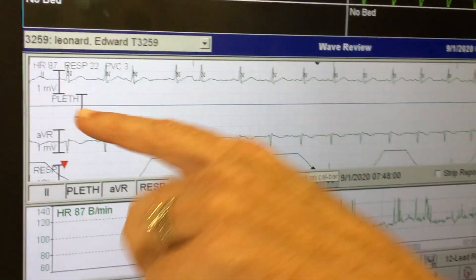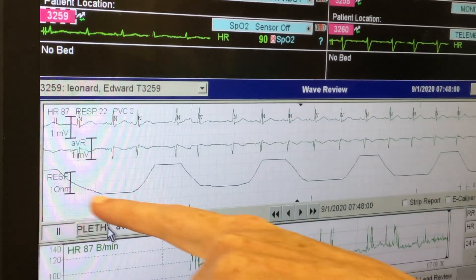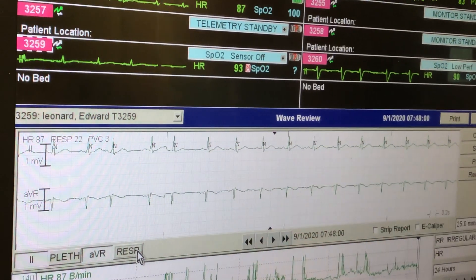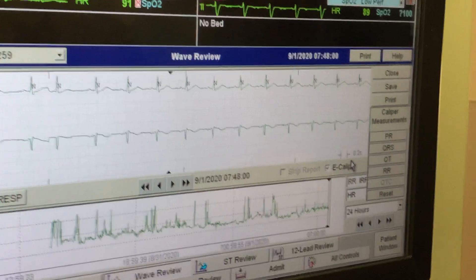To get rid of this blue line — it says 'pleth' — you can remove it because that'll print out on your strip. This is the respiratory lead; if you want to get rid of that, click it. Now it's just your EKG strip.